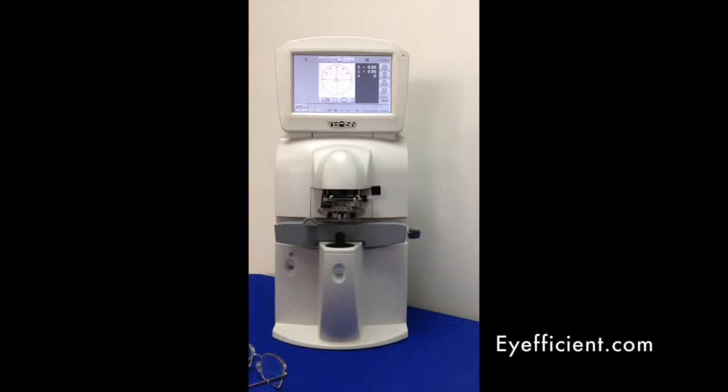This lens meter also gives you the ability to use the PD meter — you have the option to use it or not. The PD meter will give you the pupillary distance on each side plus the OU, and it will also give you the pupillary height. This instrument will also measure UV transmittance, and it's EMR ready.